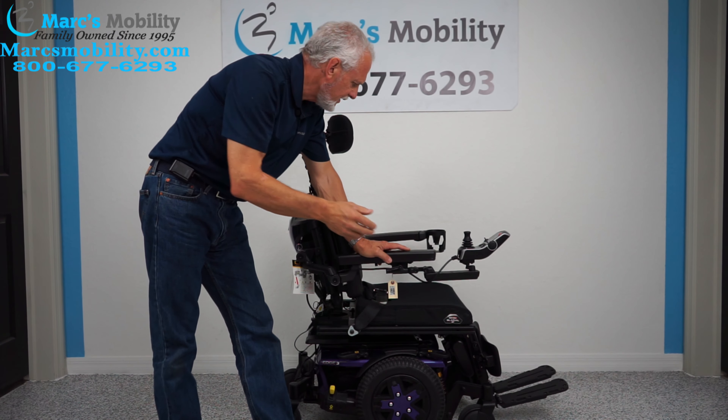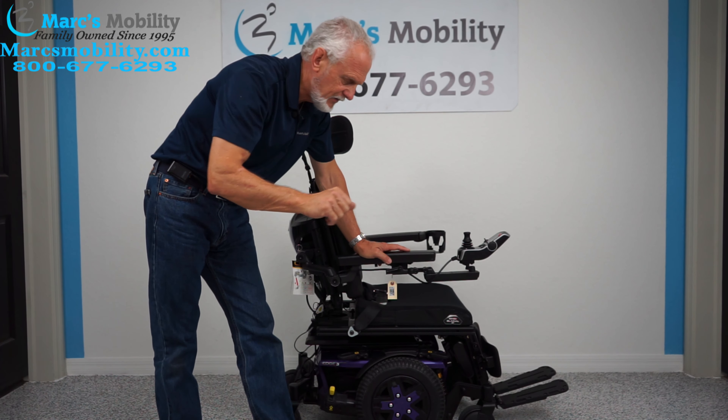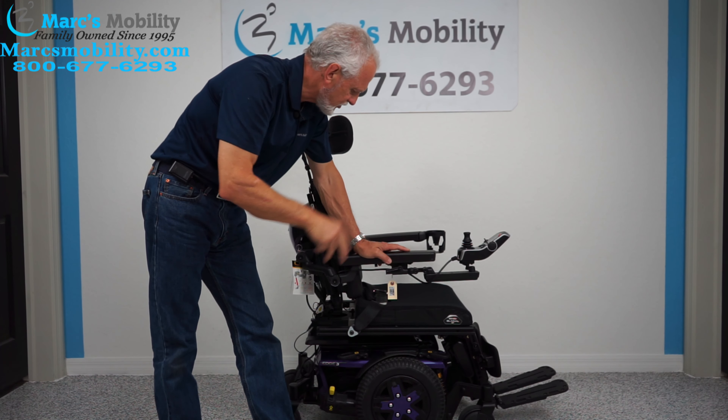It has the electric tilt, the electric recline, and the electric feet. No seat lift — tilt, recline, and electric feet: three functions.